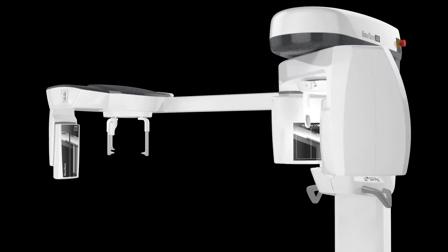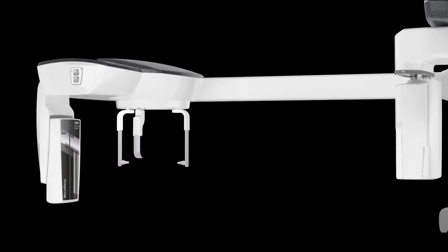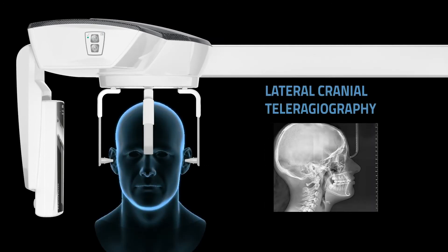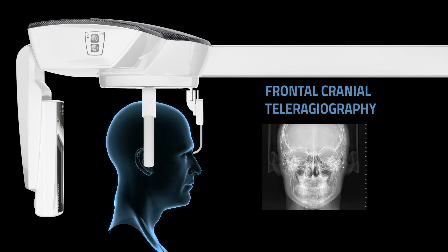When present, synchronize rotation of the 3D sensor unit. Specific child and adult examination protocols obtain accurate orthodontic assessments, as well as lateral and frontal teleradiographs.